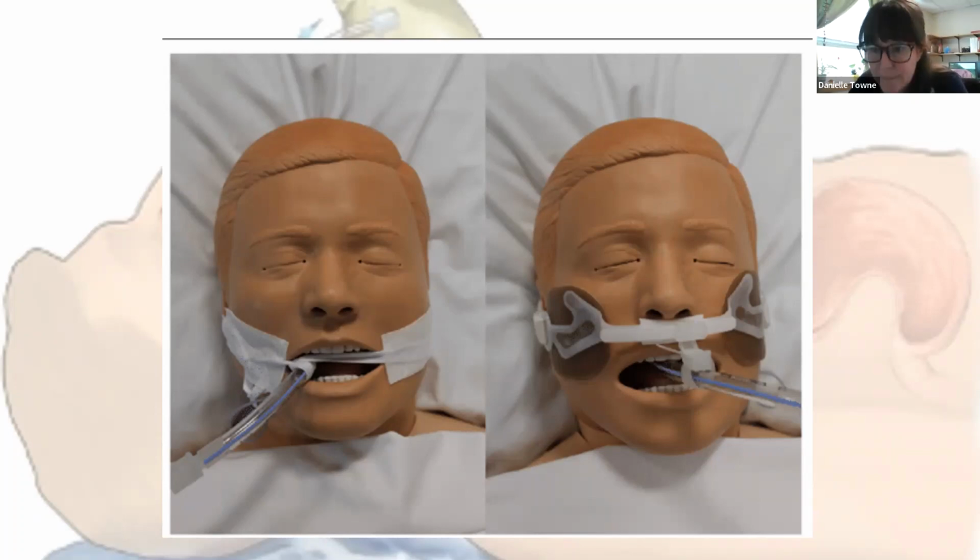Well, sometimes if your patient has been manually ventilated for a prolonged period before your intubation attempt, bagging them with a BVM, you can actually get a false positive on your colorimetric device because the excess air built up in the stomach can make it turn gold. That's why we always do waveform capnography.